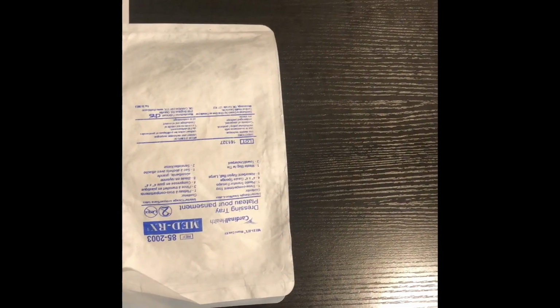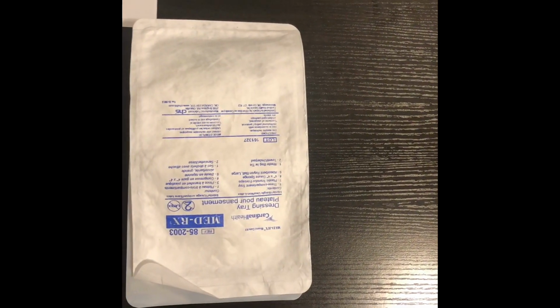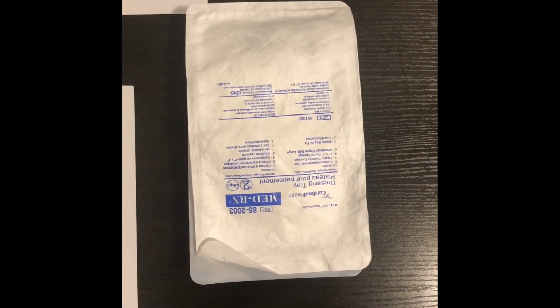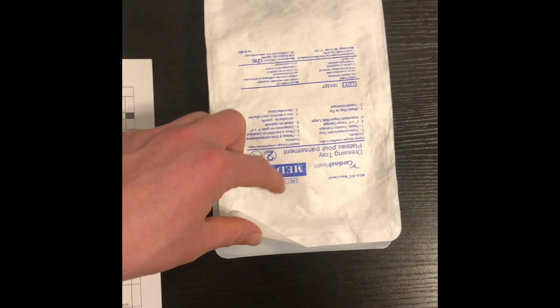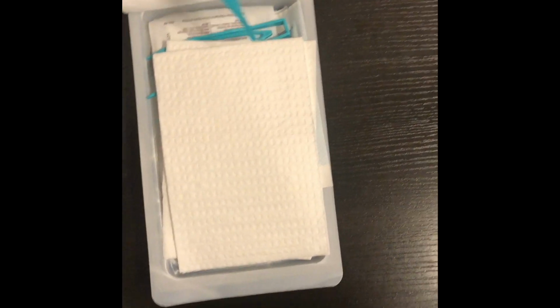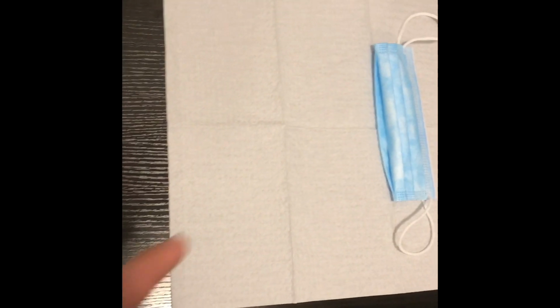After adjusting the bed to proper height, the student positions client comfortably and provides privacy by closing curtains and only exposing the wound site. Moving on, the student properly opens dressing wound tray and sets up sterile field by using aseptic technique. Student places sterile drape under or next to the client wound site, as indicated.